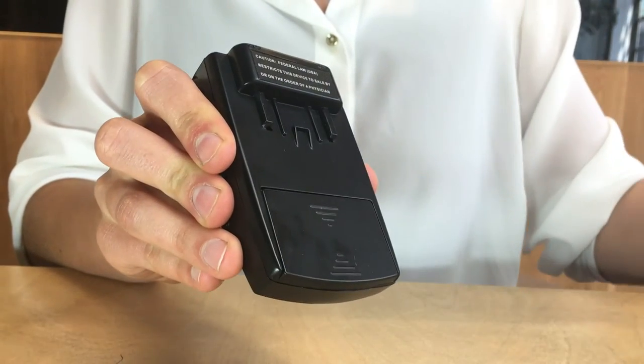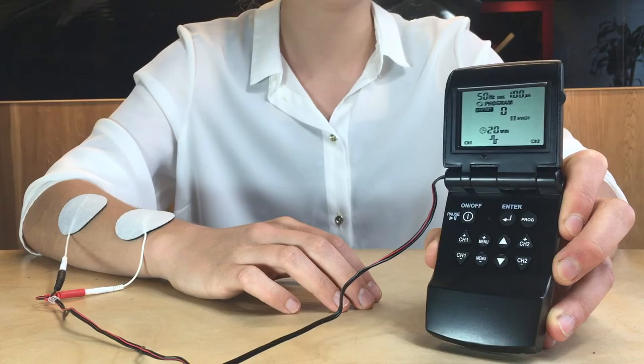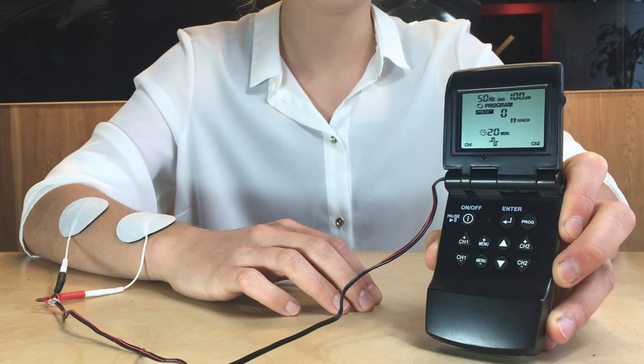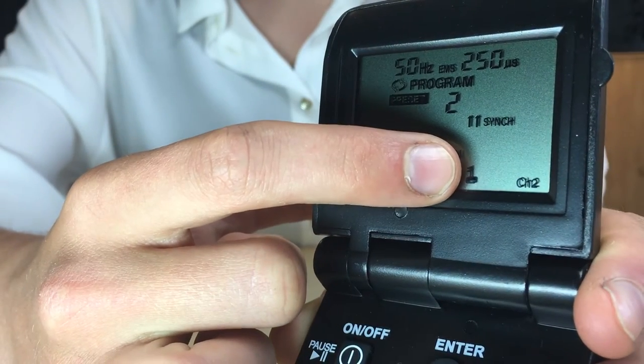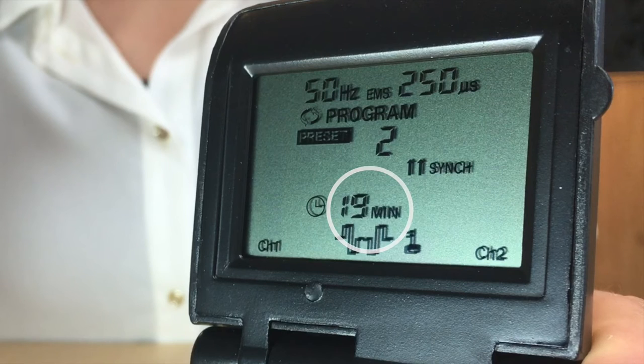To reset the device to the factory settings, remove the batteries and replace them. For ease of use and to prevent losing settings set by your doctor or therapist, the MK3 has the capability of your doctor or therapist locking Program 8 after they set it. There will be a small key showing on the screen to indicate that the doctor lock function is engaged on Program 8. If this is the case, you will only be able to adjust the timer and the intensity controls, and you will not be able to reset the device to factory settings while the doctor lock function is engaged.